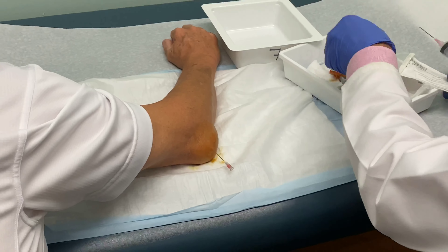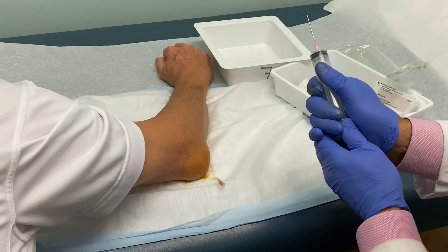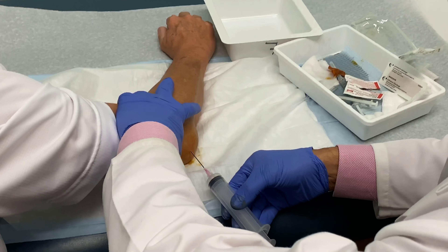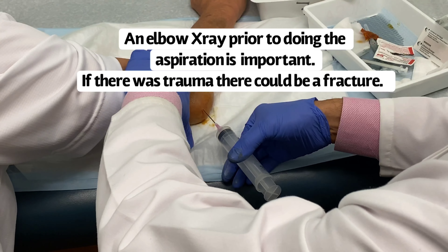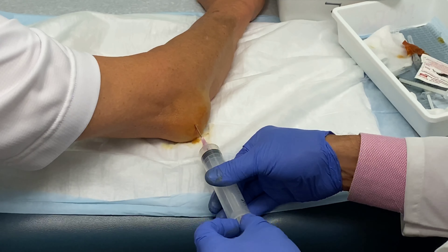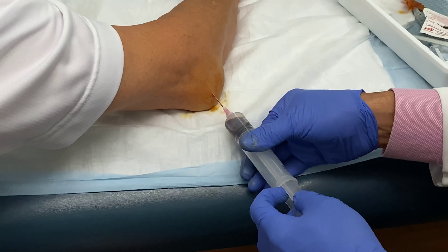One thing everyone watching needs to know: if you see this on one of your patients, get an x-ray first. Just a little bigger poke — hang in there, you okay? And there it is — you can see the blood coming out, as expected.